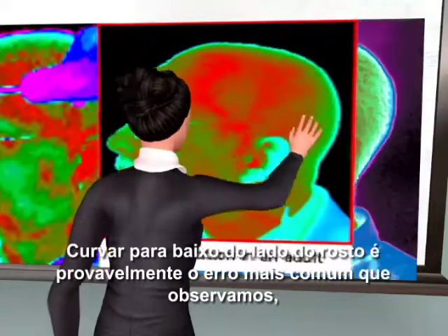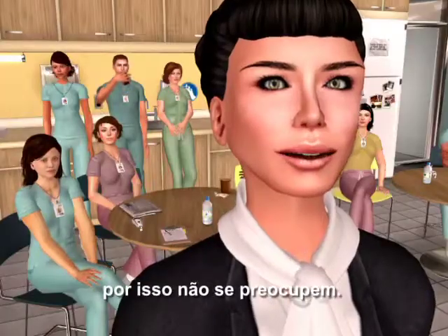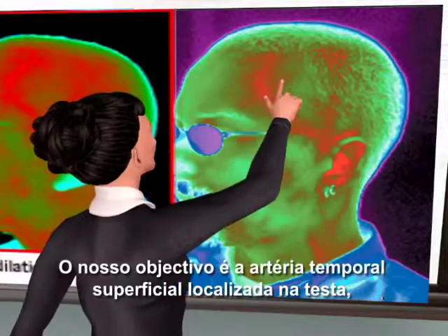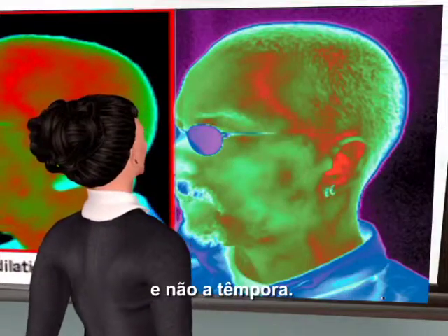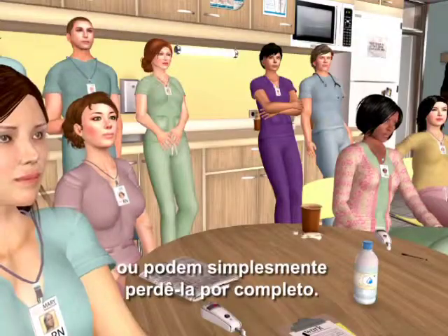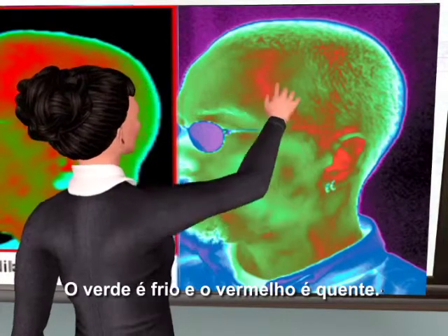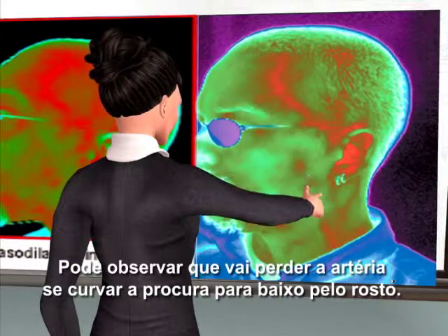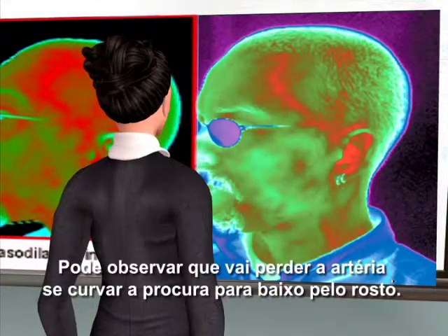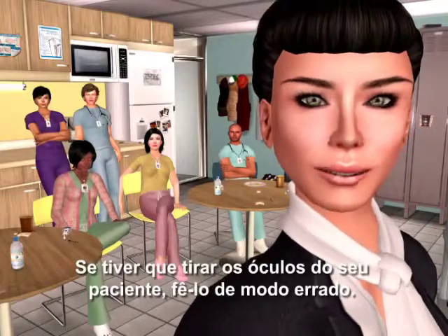Curving down the side of the face is probably the most common error we see. Our target is the superficial temporal artery at the forehead, not at the temple. At the temple, the artery can be too deep to register, or you might just miss it entirely. You can see that you'll miss the artery if you curve the scan down the face. A quick rule of thumb: if you have to remove your patient's glasses, you've done it wrong.